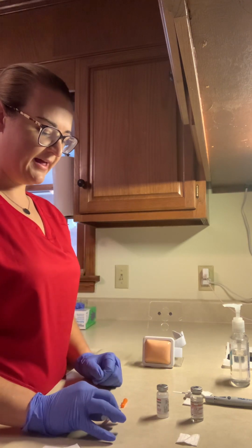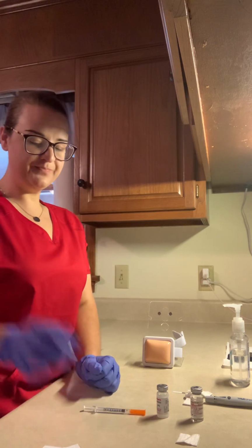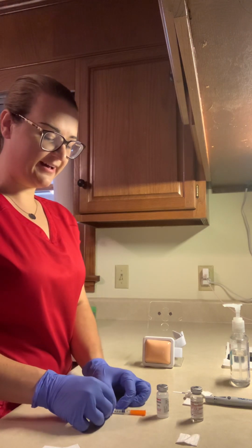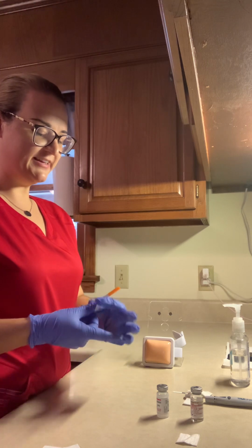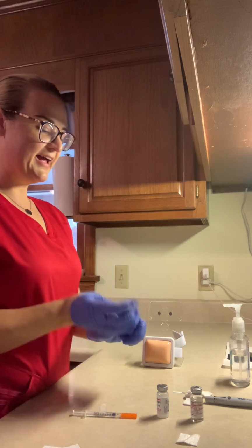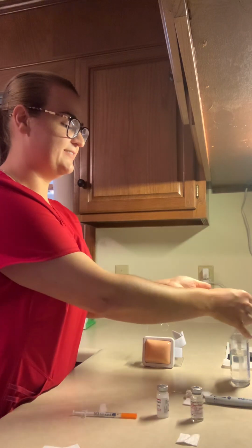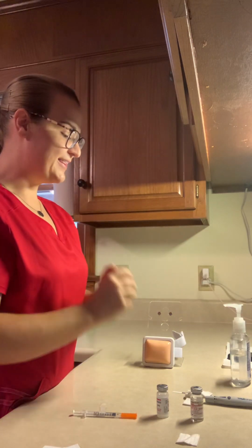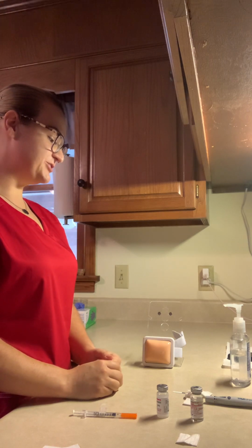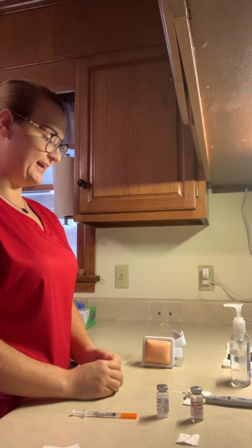At this point, I will use the scoop method to recap my needle. I will mark accordingly using a piece of tape to identify it on the patient's syringe. Verifying, I would mark, take my gloves off, and at the bedside, wash my hands too. But at the bedside, Mr. Johnson, so we're going to do a shot. It looks like your last nurse gave you a shot in your right upper abdomen. Is it okay if I give it in your left upper abdomen today?